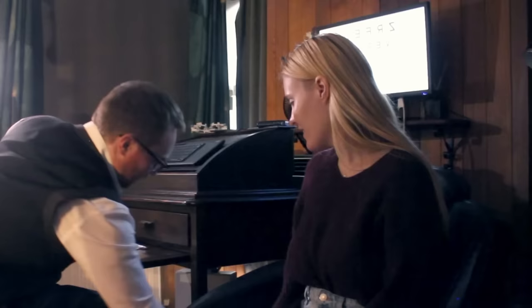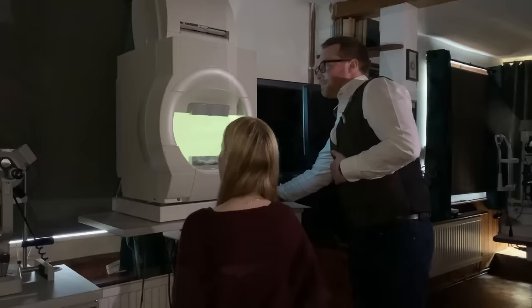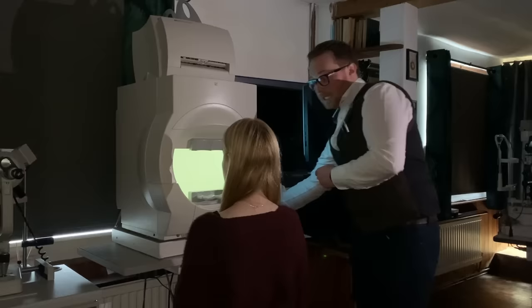But there we go. Right, that's blood pressure sorted. The last thing we've got to do is check your eyes on the peripheral vision scanner. This machine is going to check your peripheral vision. We're going to look at each eye in turn. It's going to be checking the sensitivity and the brightness of lights that each eye is able to detect.